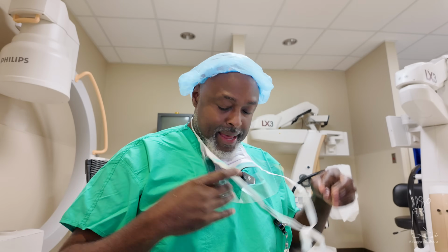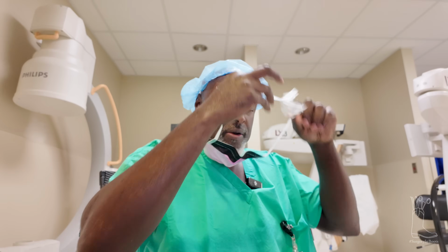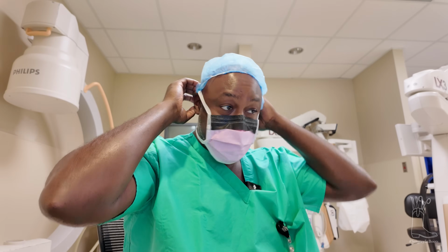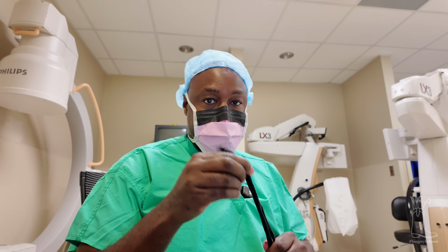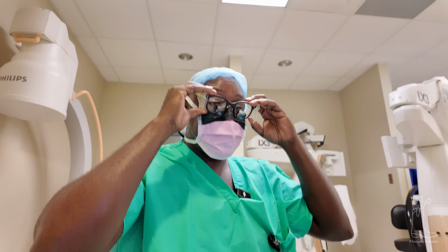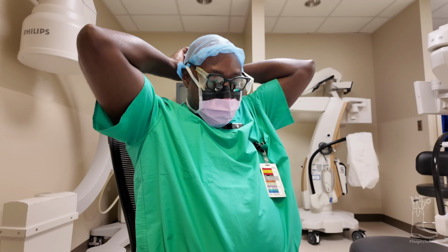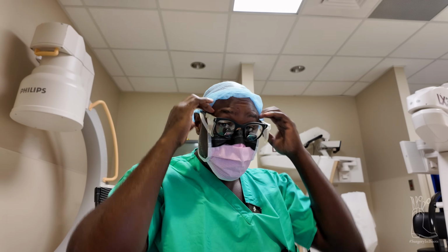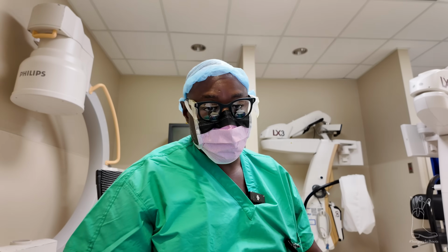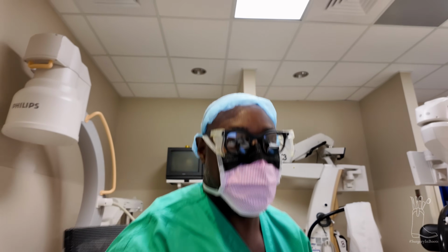Nice. This next guy has what I thought was a ganglion cyst, but it turned out to be an aneurysm of his wrist. So what we've got to do is go in and take that out. An aneurysm is basically a big bulge in a vessel. They can be painful and tender when they get big, so that's what's going on with him. And I got to use these, which magnify so we can see what's going on. Oh man, let's see if I can show you this thing, see what it looks like.